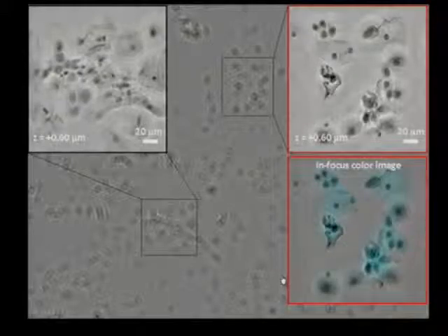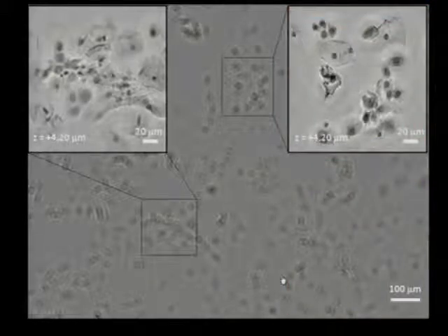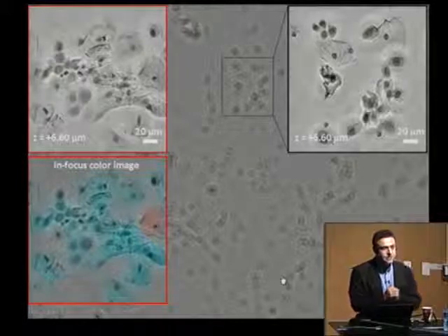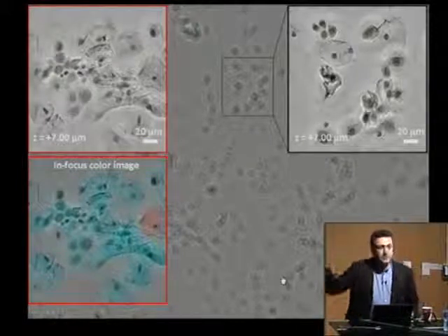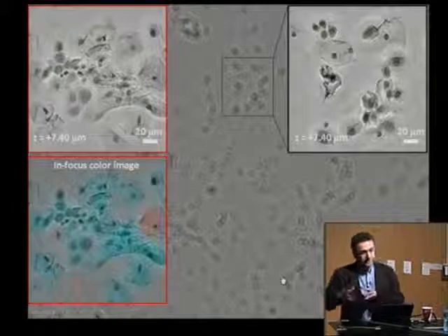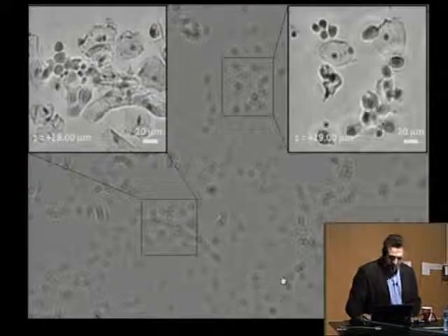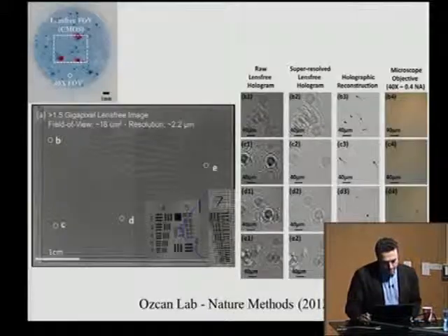And you can also do depth focusing digitally after exposure, which gives the pathologist an advantage to do out-of-focus examination, because a lot of times these kinds of samples have depth to it. So some features are out of focus because of cells wrapping onto each other. So this depth focusing is also quite exciting.